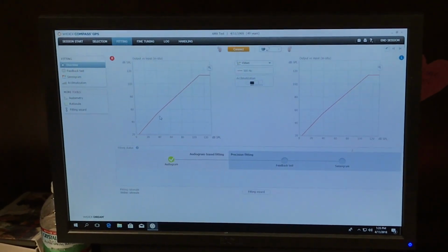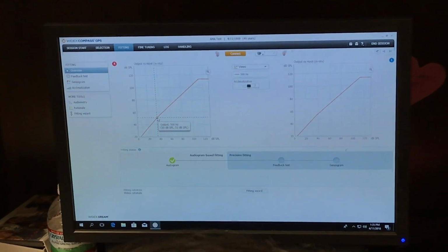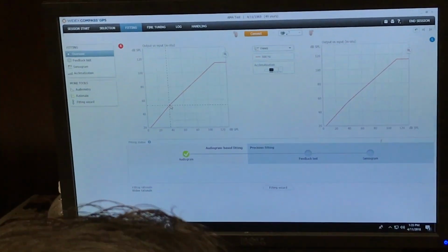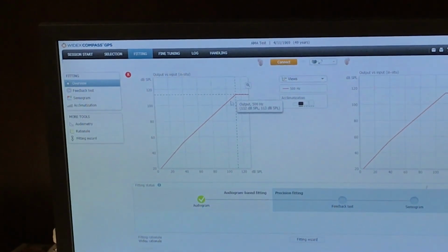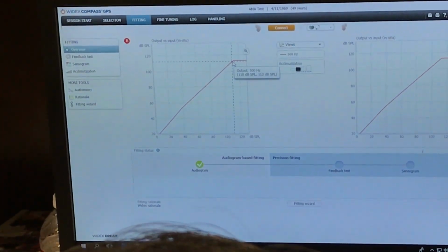Can you talk? You said that there's 2 different kinds, and one is always like that. What did you mean by that? Oh, so AGCI always has an input knee point, which is here, and an output knee point, which is here. So it's just the cutoff. Okay. So this is the AGCI part, and this is the AGCO part, okay?